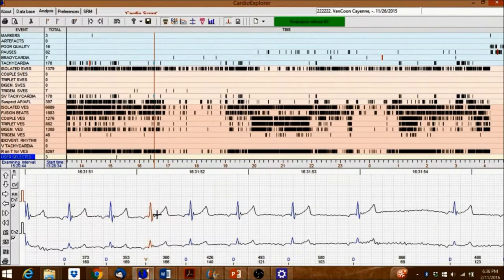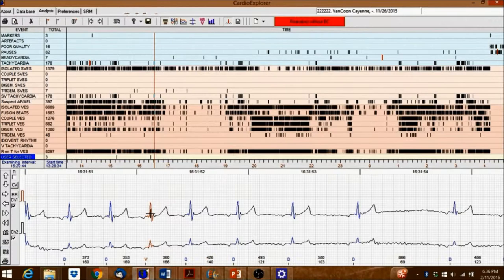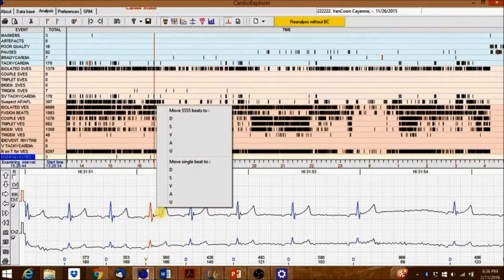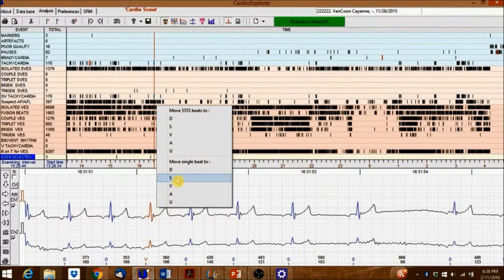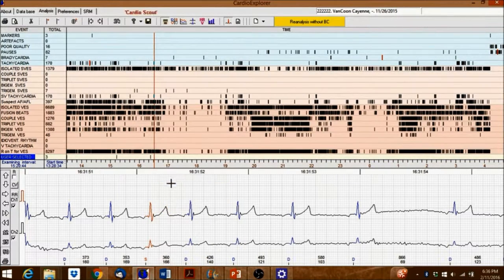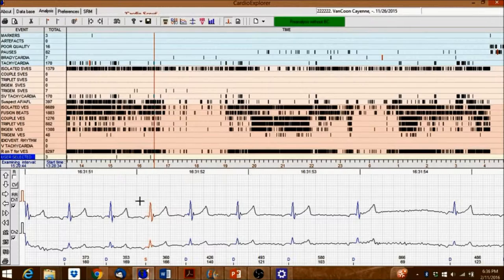Before reassigning all beats, it is recommended to make sure that the software correctly identified the beats.